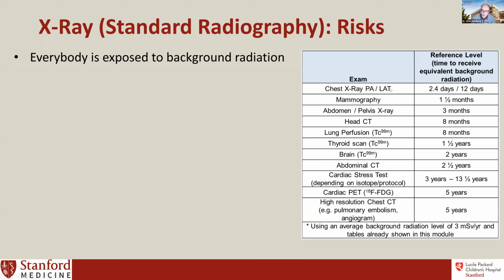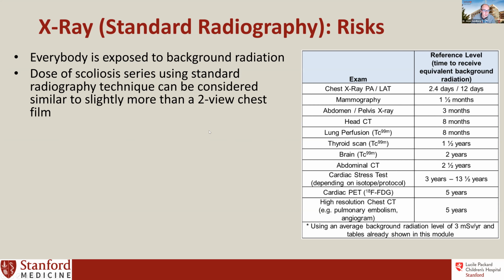In terms of physics, if you get a lateral view, it's a lot more days. I don't want to go into that, but in terms of mammography, one mammography study is 1.5 months of background radiation dose. And you can see how it increases, where an abdominal CT is 2.5 years. So, in terms of a scoliosis series using a standard radiography technique, you could think of it as maybe similar to slightly more than a 2-view chest film.